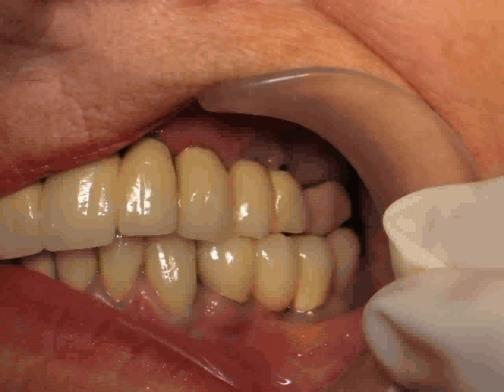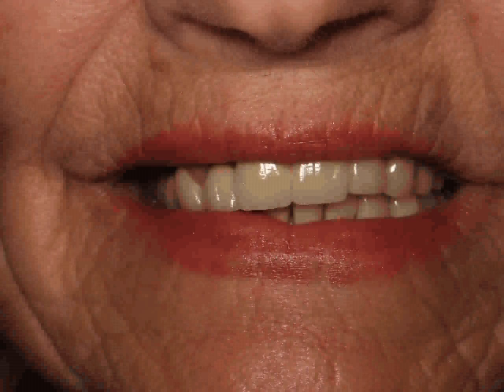The aesthetic result is the teeth are all probably 3 to 4 millimeters longer than on the right side. In this case, the patient doesn't show her gum line when she smiles widely, and so it's purely academic as to where the gum line is located. However, there are many cases where the gum line does show, so the gum line is important in many situations. When we evaluate for fixed teeth or removable, that upper gum line is very important.